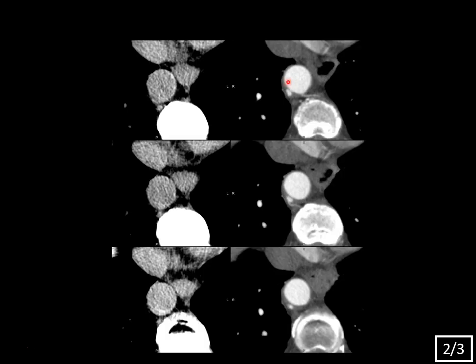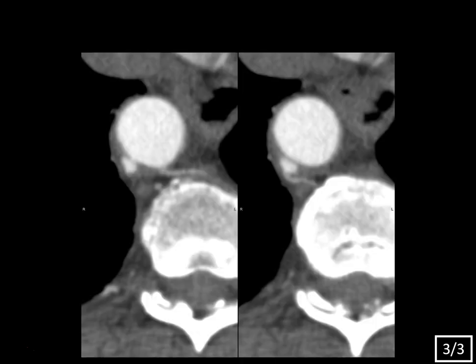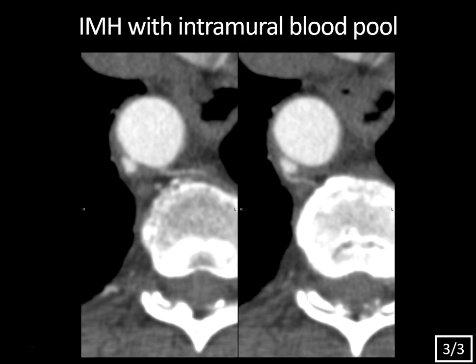As we scroll in, you see that there's this little pooling of contrast within the hematoma. So is this another ulcer-like projection? Well, if we look more closely and zoom in, you can see that it's actually not. It's something else known as an intramural hematoma with an intramural blood pool. How do you differentiate this from an ulcer-like projection, and why do you care? Well, these actually have no poor prognosis — this is just an incidental finding that often resolves over time. These tend to be a bit smaller, usually less than five millimeters in size. The key is they'll have this communication with a little branch vessel — almost like a type 2 endoleak — where this little artery is feeding the intramural blood pool, something you will not see with an ulcer-like projection.